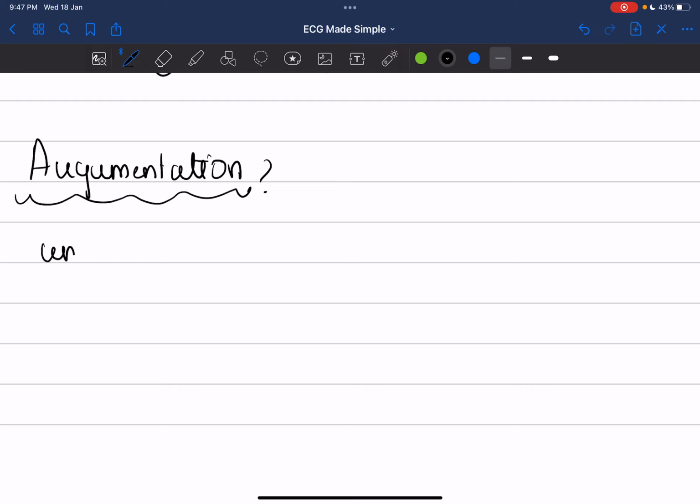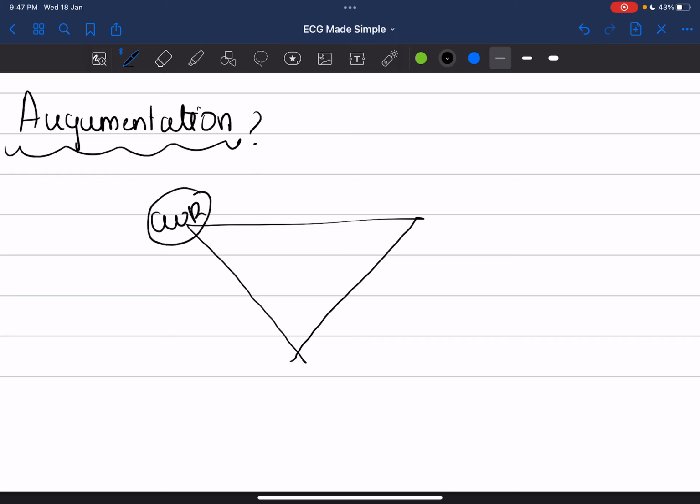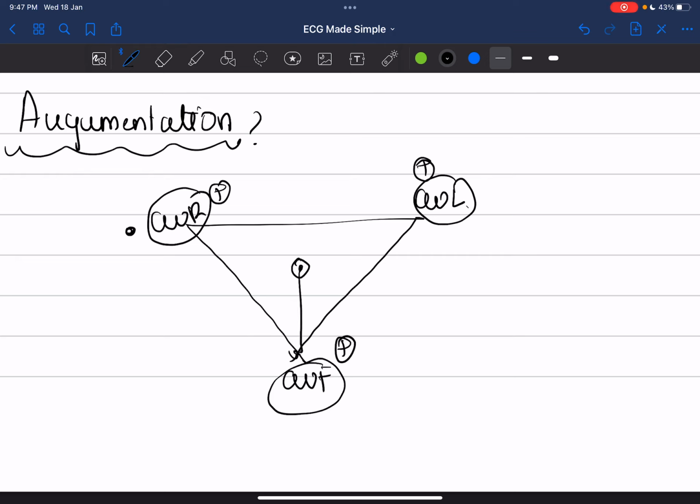So unipolar limb leads, as I mentioned earlier, will measure only from that particular area. So consider these 3. This is the AVR. It measures electrical potential over the right shoulder, and AVL over the left shoulder, and AVF here. It measures only potential difference. All 3 are considered as positive electrodes. And we have an imaginary central negative terminal, called Wilson's terminal. The direction goes from the negative electrode towards the positive electrodes.